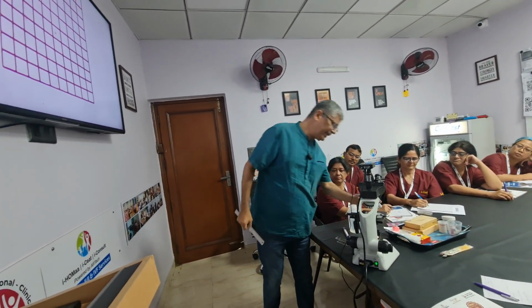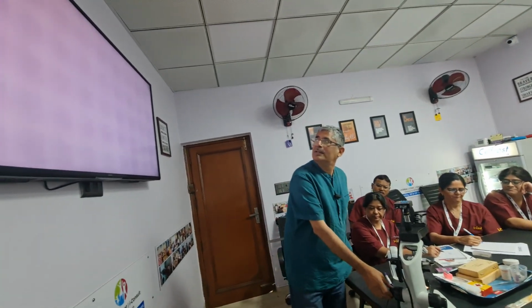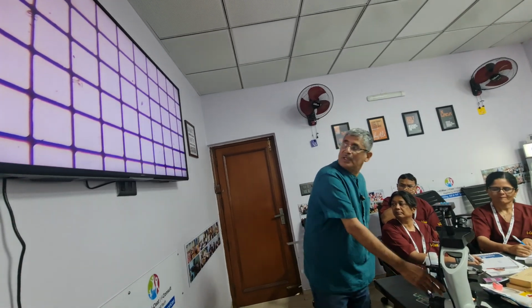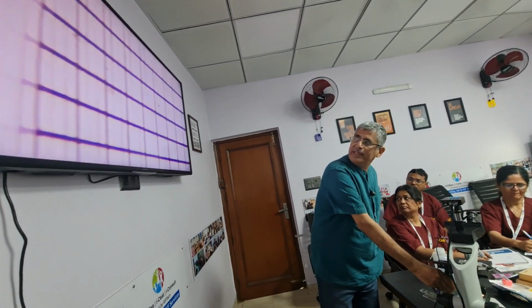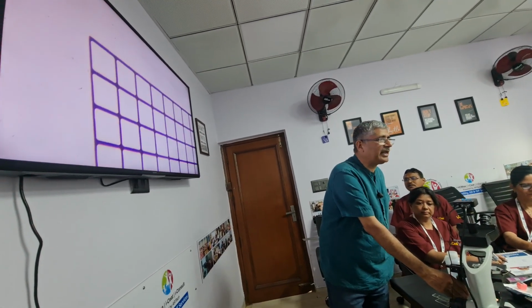Yes. Now I want to go to 10x. So I just go around and go to 10. Where will I go? Towards me. Difficult? No. So every 10 minutes you are inching towards your 15 lakhs per year plus a doctor employed.